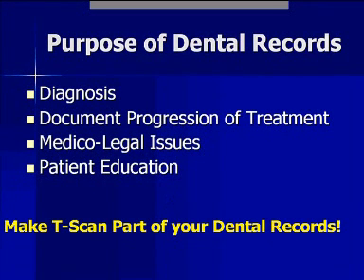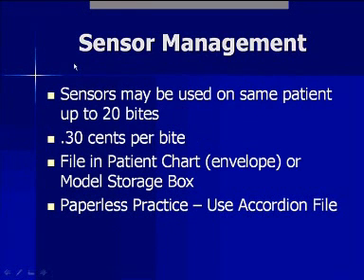Even 3 years ago, in training on TScan technology, we used to start our presentations by showing how to minimize and maximize a window, but we don't have to do that anymore because most of you are whizzes at the computer. And this is why the TScan software is Windows-based, very easy to use, and if you can roam around in Windows and use the internet, you'll have no trouble understanding the software. But basically, you have to make it part of your records and take the data so that you become very, very good at it.